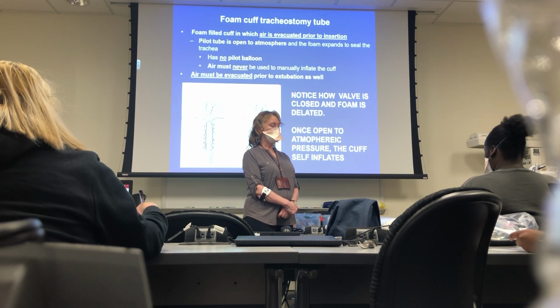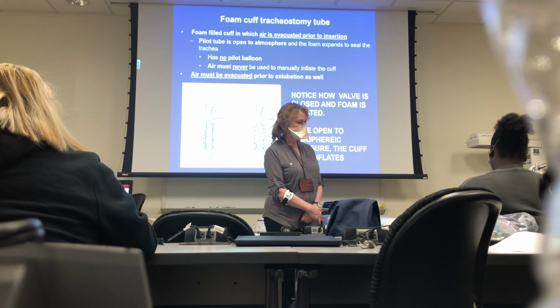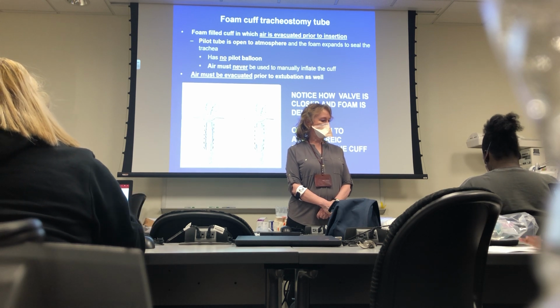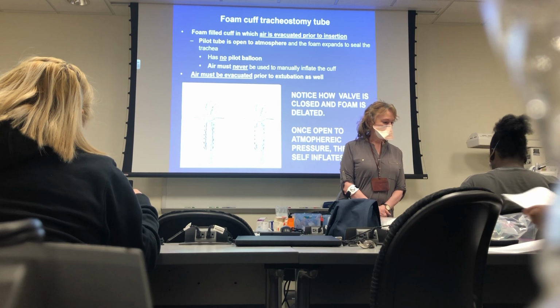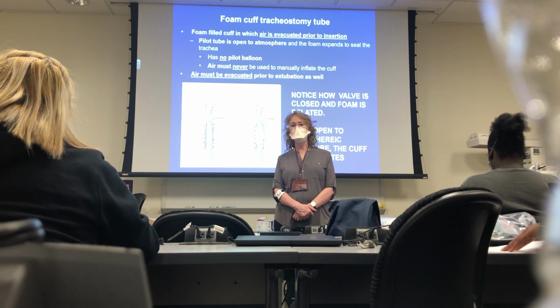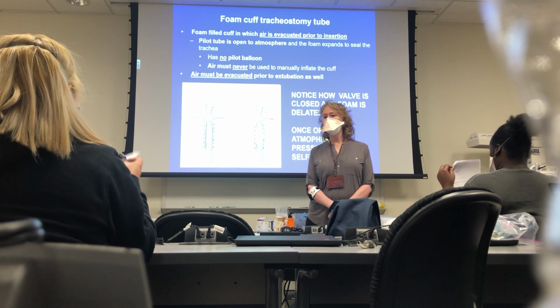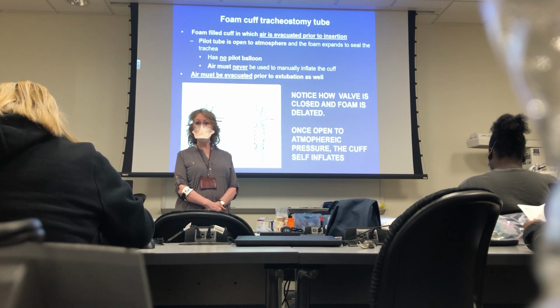I don't think the Carlens tube is on there, is it? The Carlens tube, that's for independent lung ventilation? No? Okay, how about the LMA? Laryngeal mask airway. This is the one? Laryngeal mask, yep. Okay, we doing good?